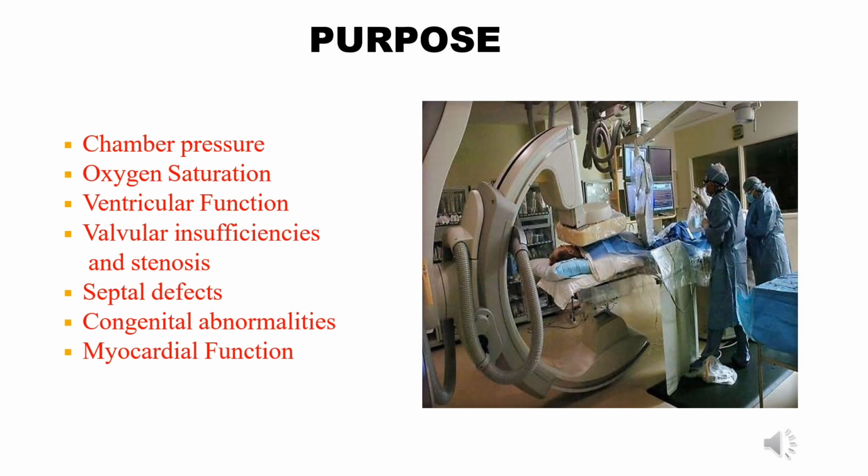What are the purposes of doing cardiac catheterization? To visualize chamber pressure, oxygen saturation, ventricular function, valvular insufficiencies and stenosis, septal defects, congenital abnormalities, and myocardial function.